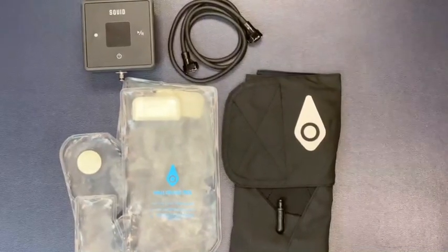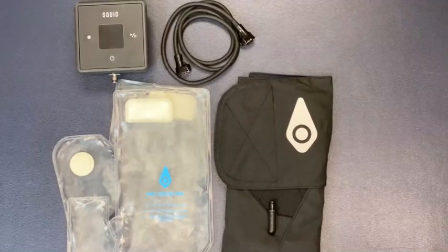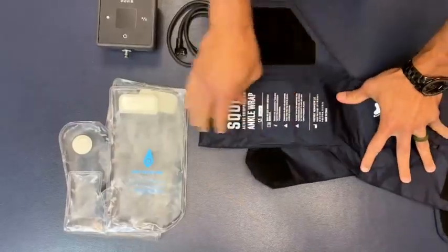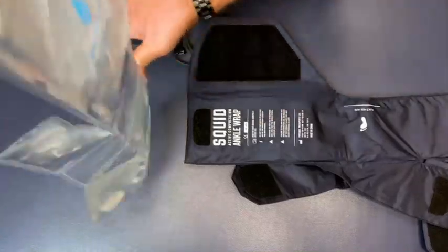Once the control unit is fully charged and the gel pack is frozen, you're ready to get started. Setup is quick and easy. Attach the gel pack inside the wrap using the Velcro tabs.